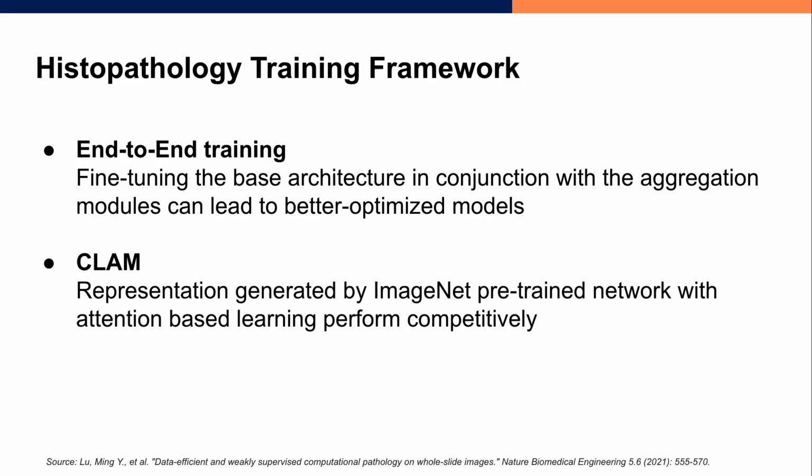These assumptions are not always right and have increased the interest in end-to-end training using WSI, in which both the patch feature generation module and the aggregation module are trained together in synergy, going away from all the previous assumptions. And it has been observed that these architectures lead to superior performance. C2C by Sharma et al. and Beyond Classification by Z et al. are some of the examples.